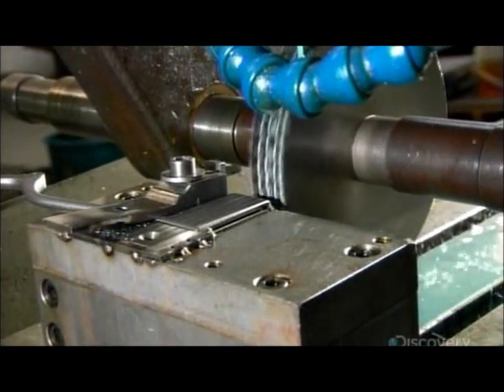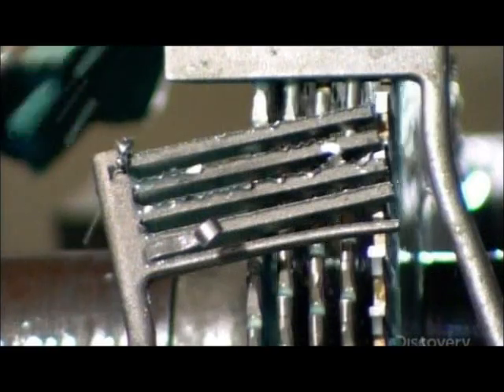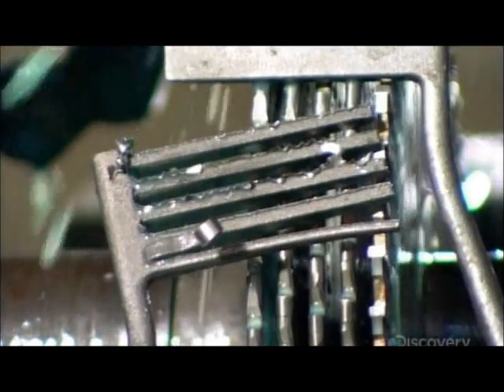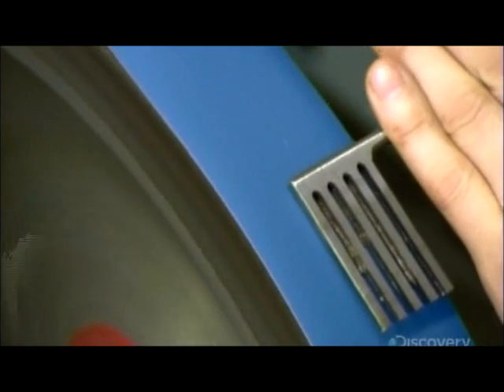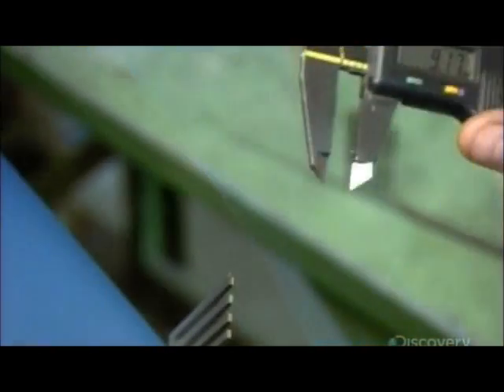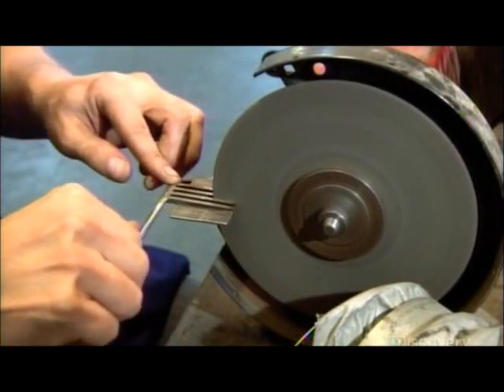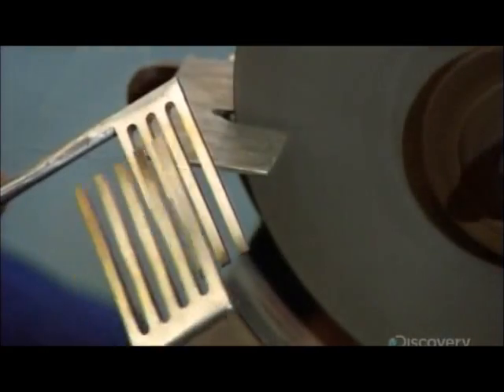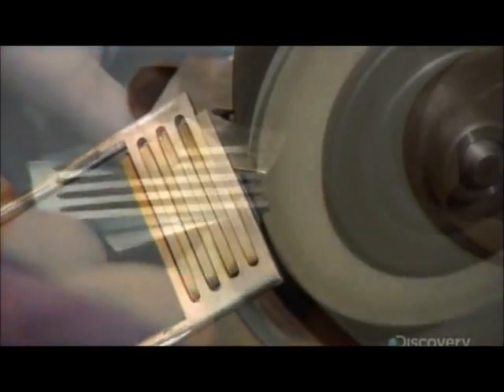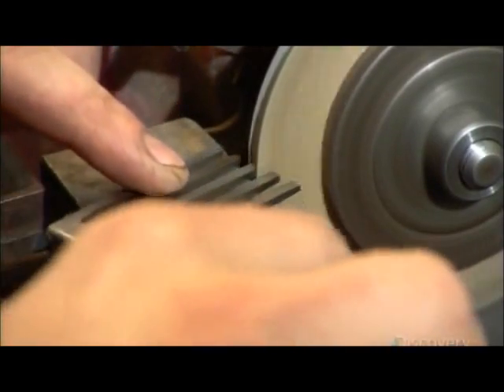Next, cutters carve slots in two parts to create the retractor's intermeshing jaws. These jaws will be used to grasp and retract body tissue so the surgeon can operate. A technician sands the teeth down to a precise size — he must be accurate within a quarter of a millimeter. He then smooths the jaw's teeth against a fine-grit wheel so they'll easily intermesh when needed.